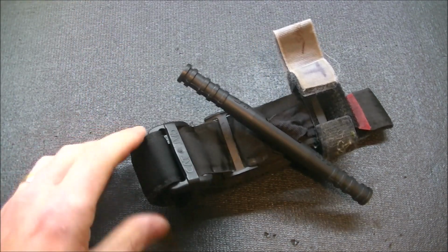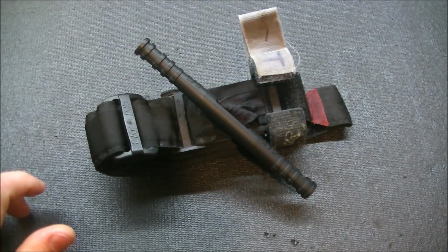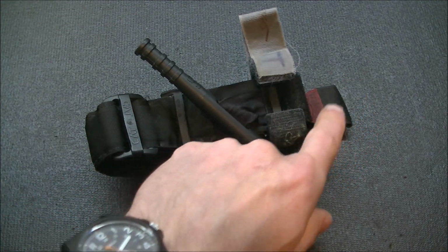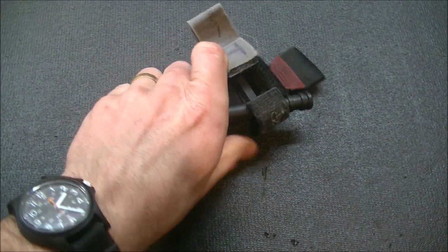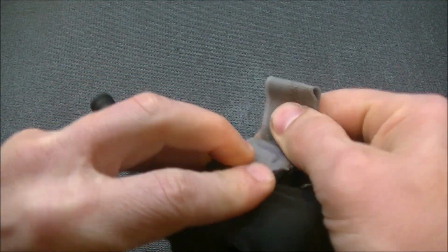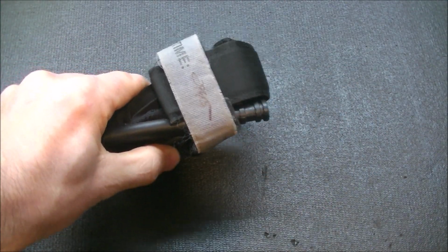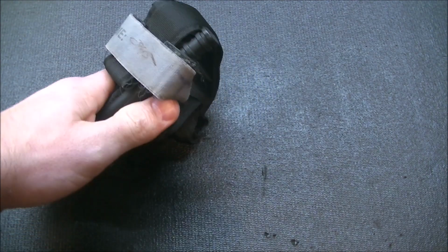So you still want to use the Velcro to prevent tearing of the material over time, but then you can crank the windlass without having to worry about the Velcro being exposed to blood and not having a very good grip or anything like that. But the way you secure it, in my opinion, should be the same as the cat. Once you're done doing the windlass and you get the windlass inside here, you get your strap here and you flow it through the top here, and then you put your marker or your time strap over the top there, just like so. Put all your excess through there and then hold it down with the time strap.